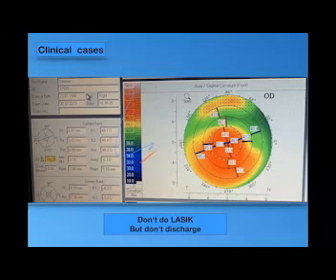After this check and after checking the other eye, I will have two options, either to follow up the patient or to do cross-linking, but with correlation with the clinical data of the patient and the other eye. Okay, but I think we may find it strange that the astigmatism in this patient is negligible, right? We used to find high astigmatic error in keratoconic corneas.